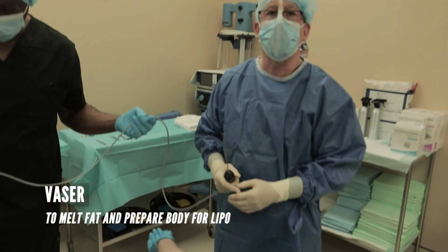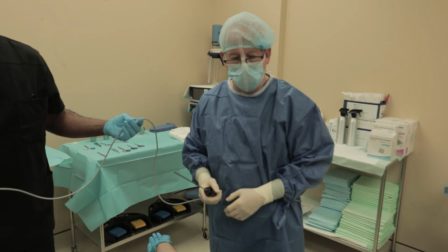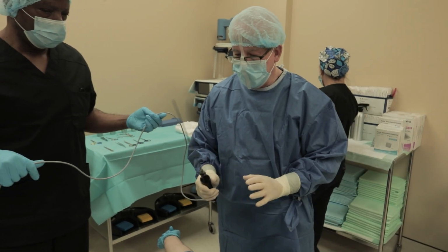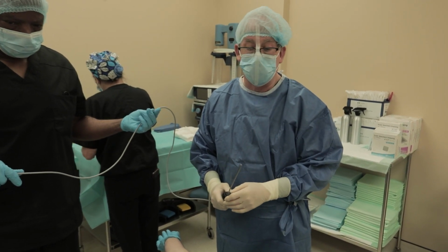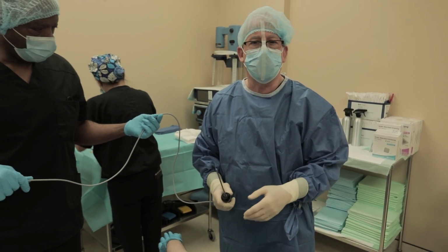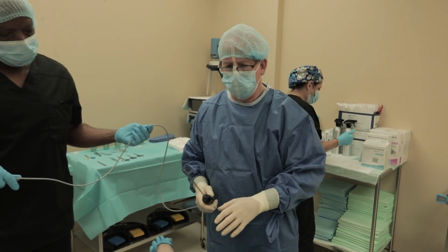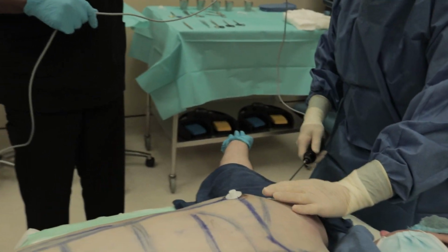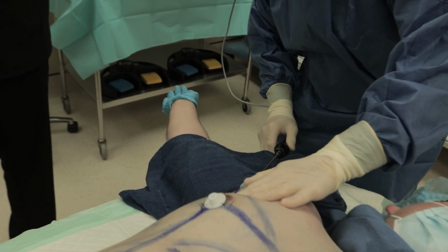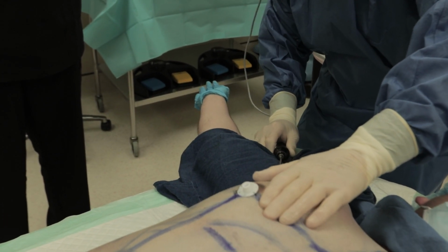Guys, so now we're doing the Vaser. He's all numbed up. We gave him some time to relax and get that numbing all in there. It's local anesthesia. So first thing we're doing is the Vaser. I got the 2-ring. Standard is I do the 2-ring. It comes in 1, 2, 4, and 5, but I like the 2-ring, 70% inside my stealth incisions. And here we go. We start to melt this fat and melt the gland.